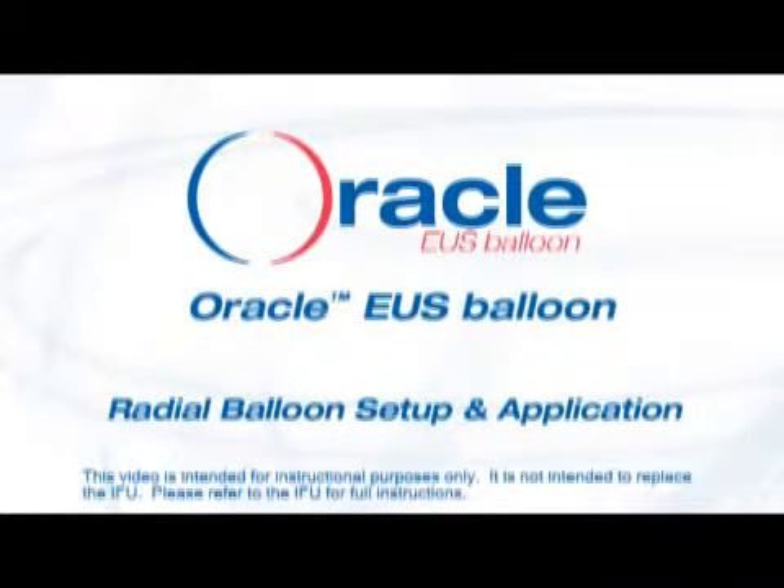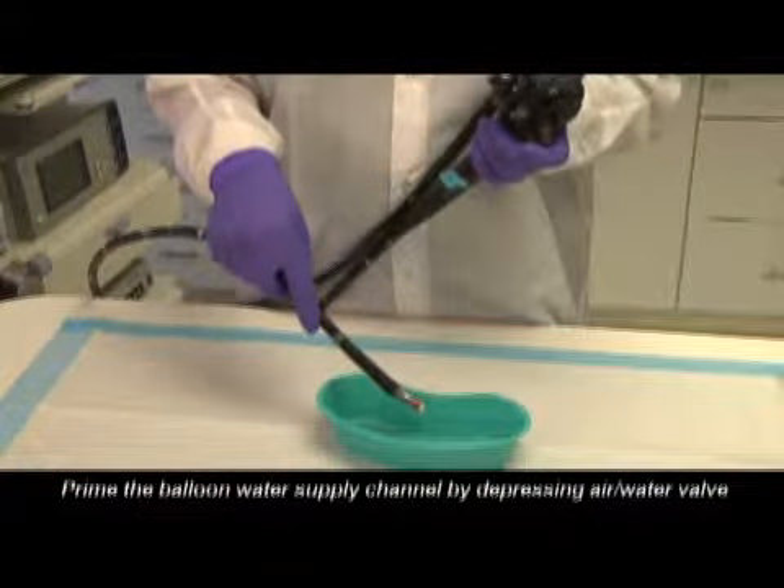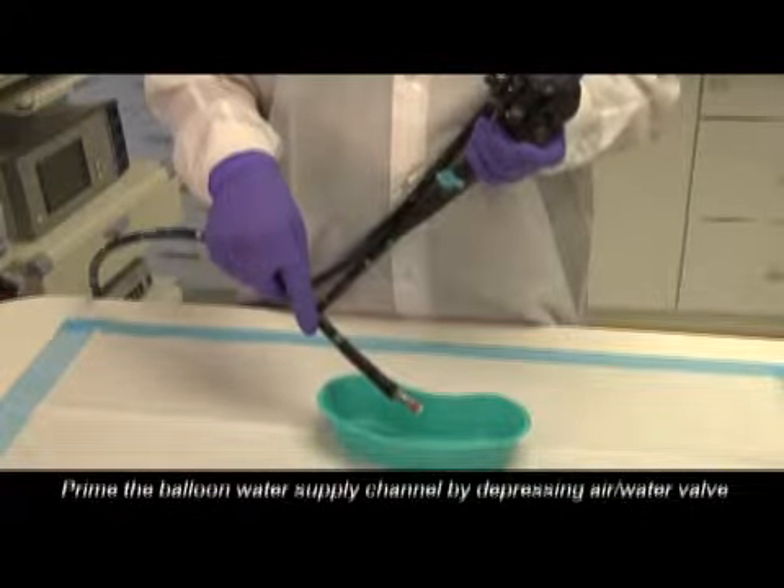The Oracle EUS Balloon Radial Setup and Application. Prime the balloon water supply channel by depressing the air water valve.